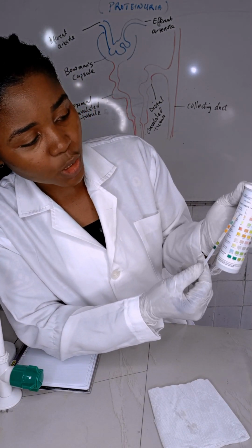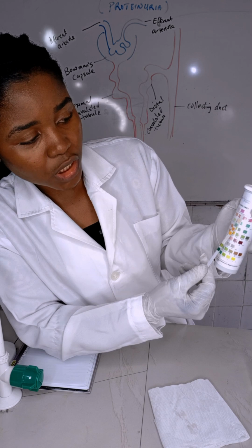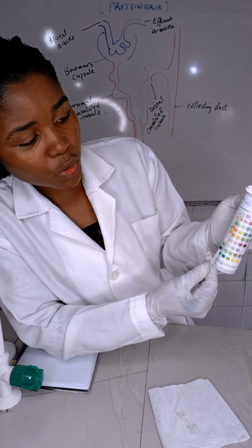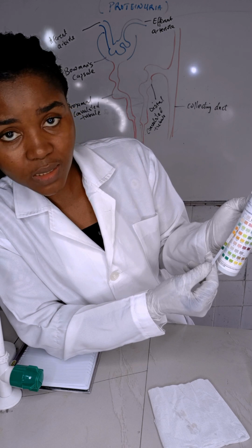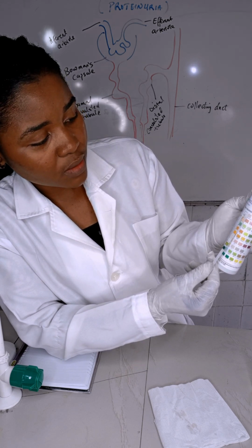The first one is nitrite, which was white. It remained white. There is no change. The second one is urobilinogen, which was pinkish. It remained pinkish. There is no change. That means there's no nitrite, there's no urobilinogen. The next one is protein.